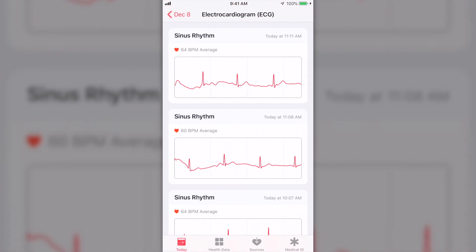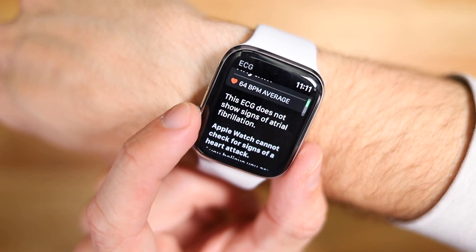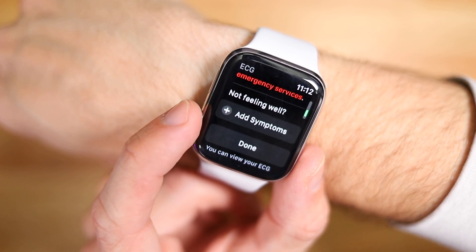It's a really simple, fluid, easy-to-use feature. As you're using the ECG function, you'll also notice that it warns you right on the screen that Apple Watch never checks for heart attacks. So I guess that means if you think you're having a heart attack, don't open an app on your watch — instead, call the ambulance, because you're having a heart attack.